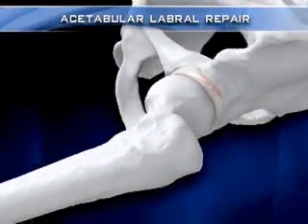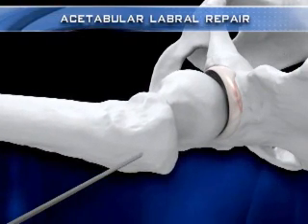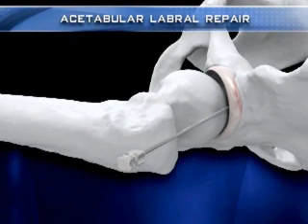Arthroscopic acetabular rim osteoplasty with labral takedown and resultant labral reattachment begins with the establishment of the anterolateral viewing portal. Using an outside-in fashion under fluoroscopic guidance, a spinal needle is advanced over the anterior border of the greater trochanter into the femoroacetabular joint space while the hip is being distracted.